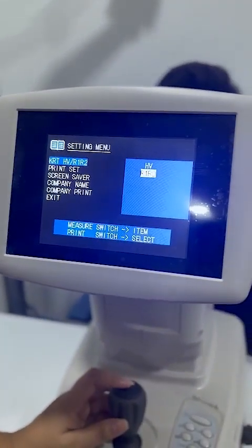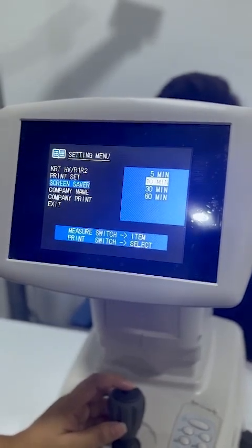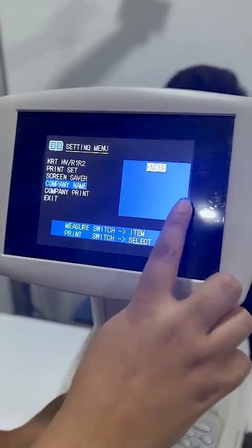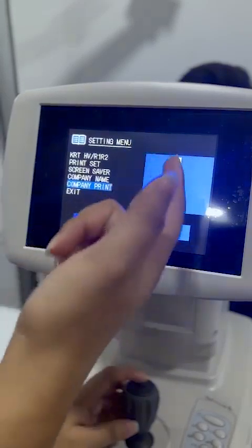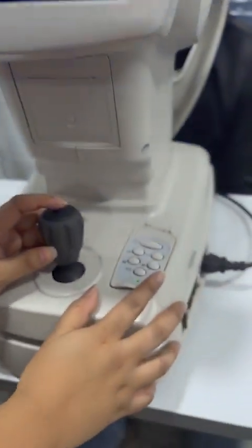R1 R2 is the standard one. Printer settings you can also set, and screen savers for 10 minutes. If you want to add a company name you can add it from here, and if you want to print the company name in the AR report, you can do so from here.